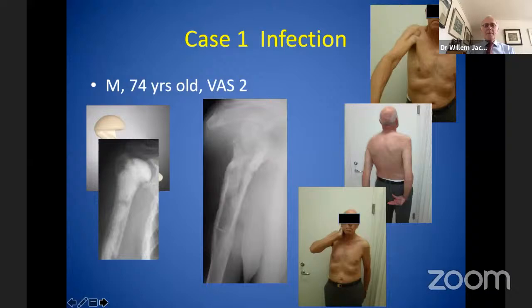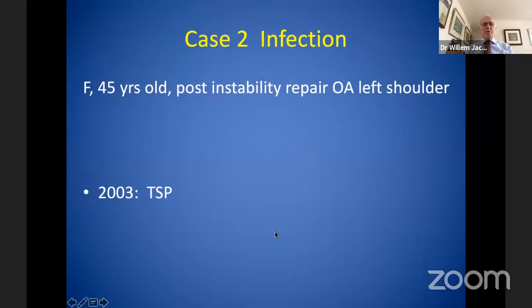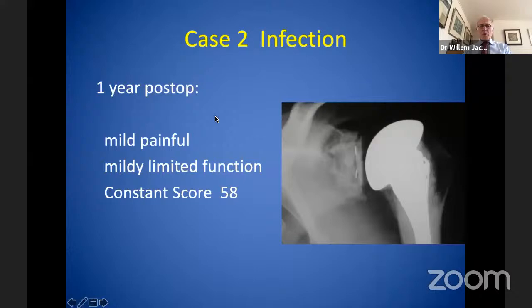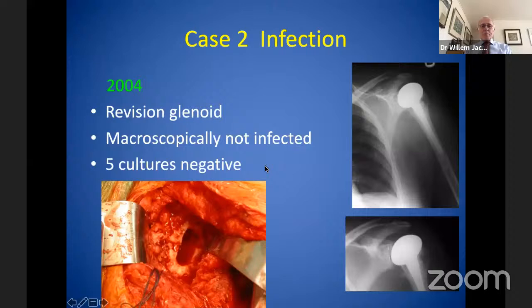Case two, a 45-year-old lady, post-instability osteoarthritis in the left shoulder. She had a shoulder prosthesis inserted in 2003. And this was her X-ray and her CT scan. The perioperative cultures were negative. 1 year postoperatively, mildly painful, limited function, and a Constant score of 58. And here, a loosening of the glenoid already after 1 year. We did the revision of the glenoid, macroscopically not infected.